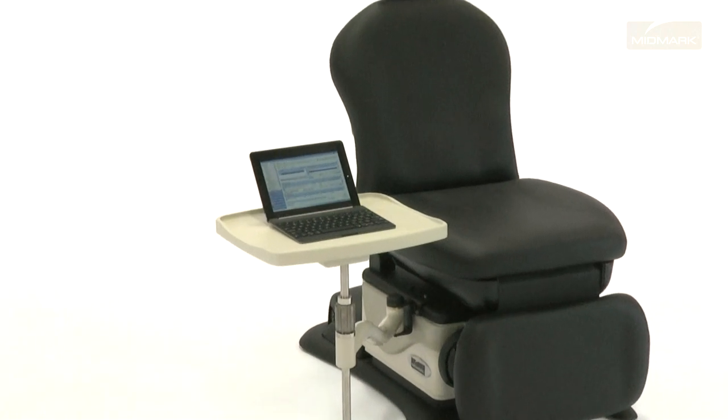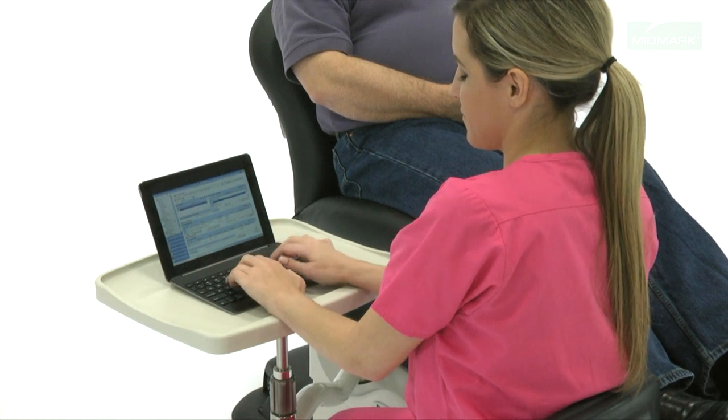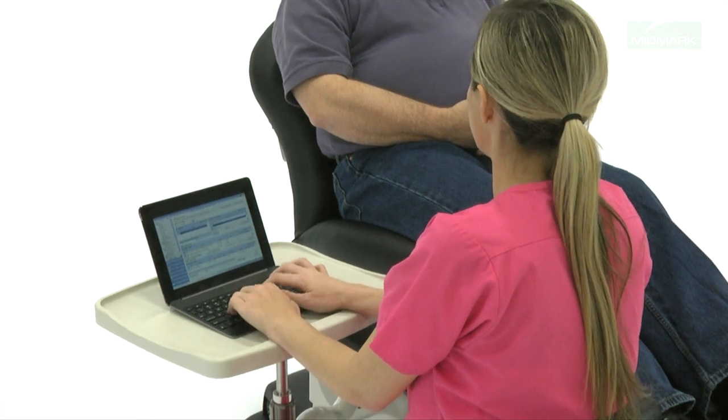A more basic option is the swingarm PC workshelf. Designed for placement of a laptop or tablet PC near the patient, this workshelf can also be a convenient work surface for charts and files, or can be used as a writing surface.